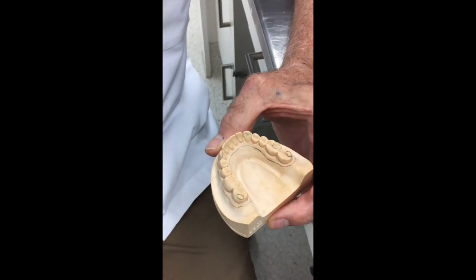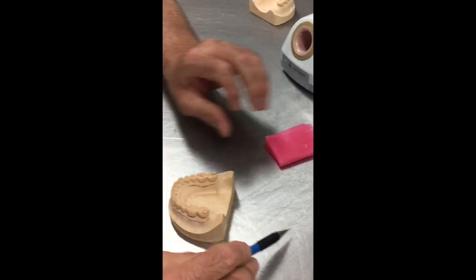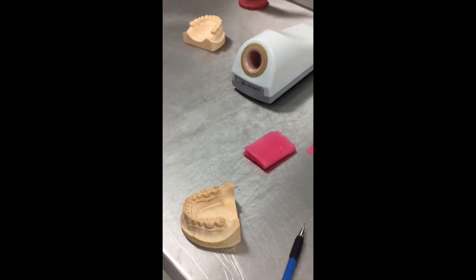Once we've got the outline, we're going to take our wax and create the space. There are lots of theories about the space, and we need to look again at the consistent result. Usually with crown and bridge material, we want to just fill the undercuts and then leave a consistent space of one layer of wax. Two layers of wax is too much. One layer, after we fill the obvious undercuts, we find is the perfect result. We get a consistent result, economy of material, and yet we are able to take this out of the mouth comfortably, and we are able to pour the model accurately in the laboratory.